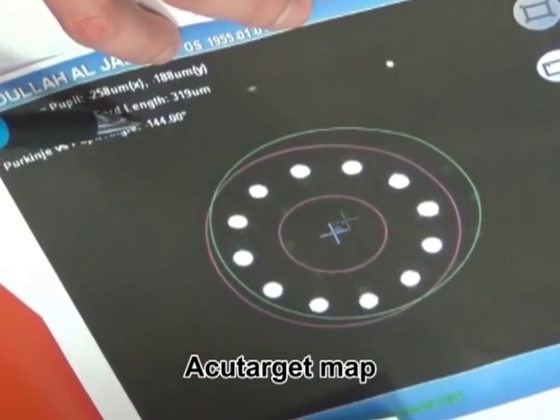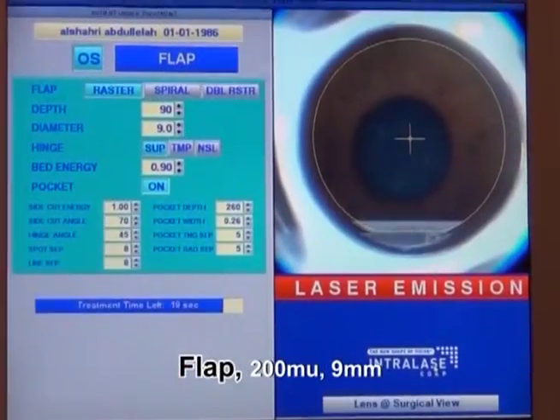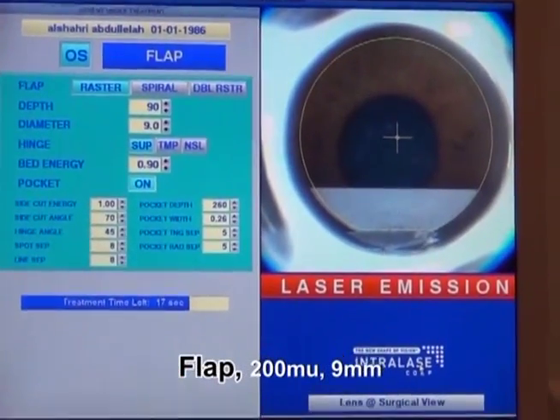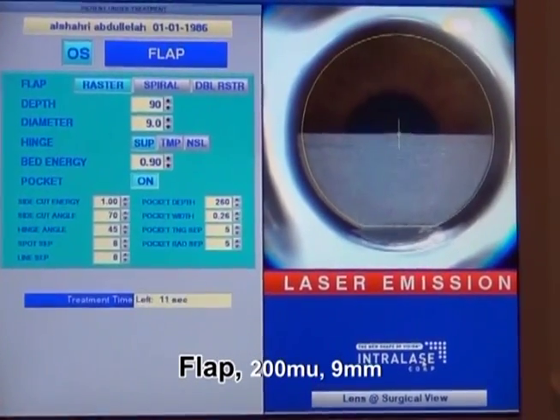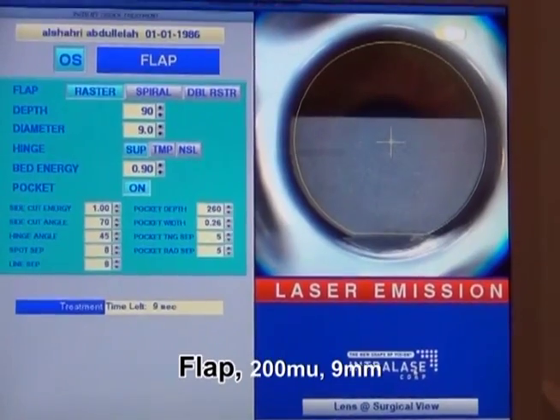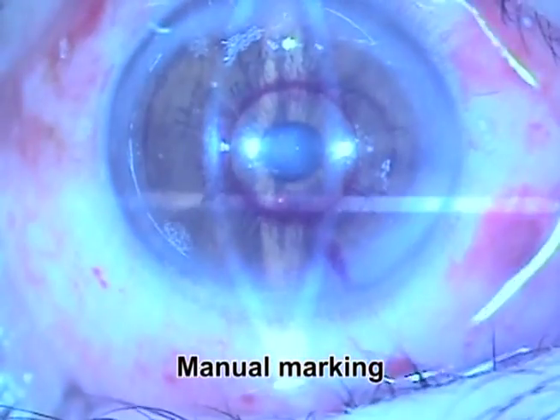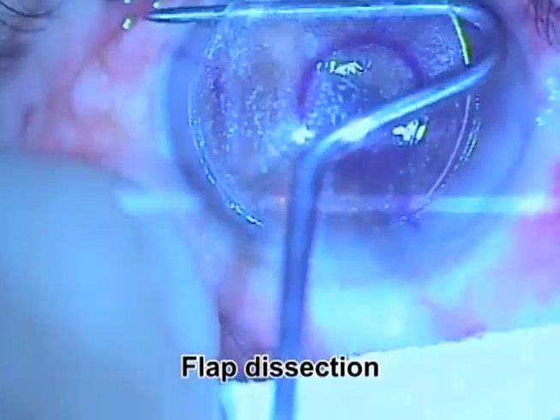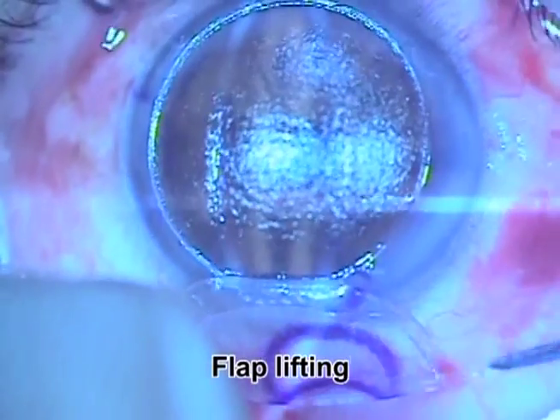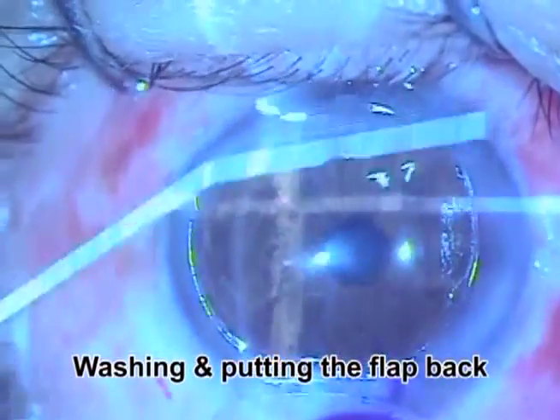The AcuTarget map is used to find the prime location for putting the corneal inlay. After that, you make a 200-micron flap of 9-millimeter diameter, usually using a femtosecond laser. Then you make a manual marking of the center of the pupil, dissect the flap, and lift the flap. After that, you perform the photo-ablation.